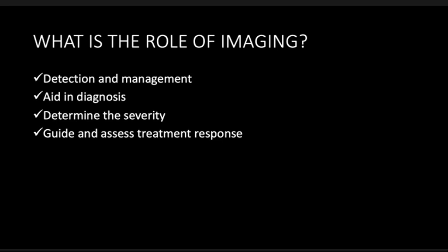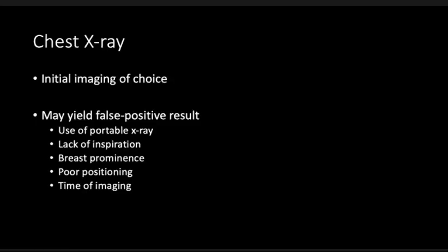So the study of clinical, laboratory, and imaging factors associated with disease severity is key to promoting effective treatment strategies that reduce complications and mortality. So first, I will be discussing the chest X-ray. The chest X-ray is the initial imaging of choice since it is widely available. However, using chest X-ray has its limitations.